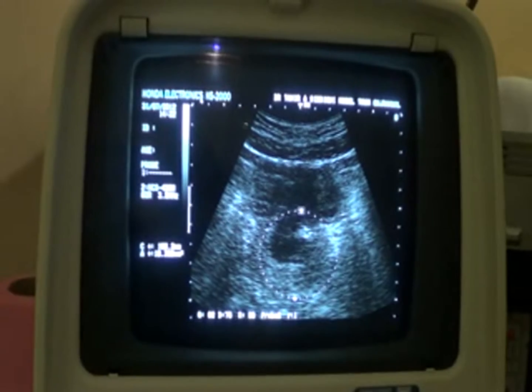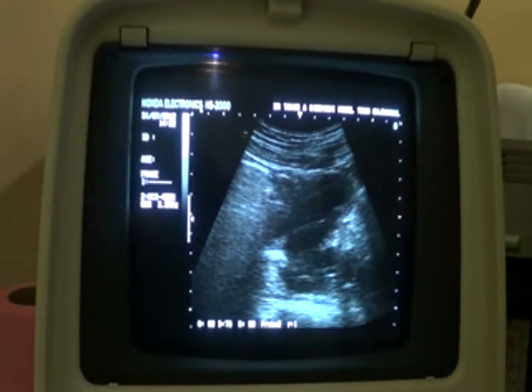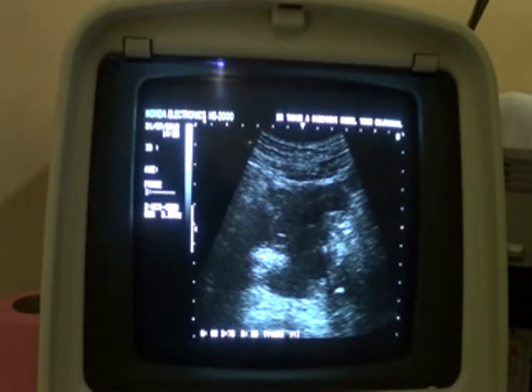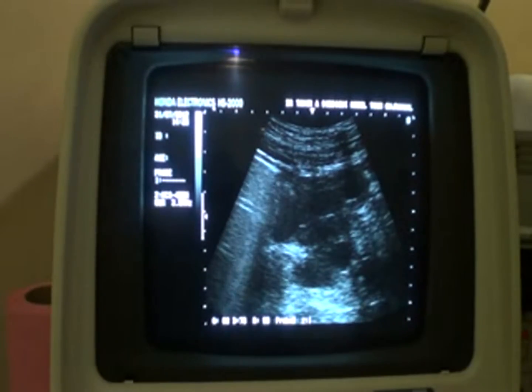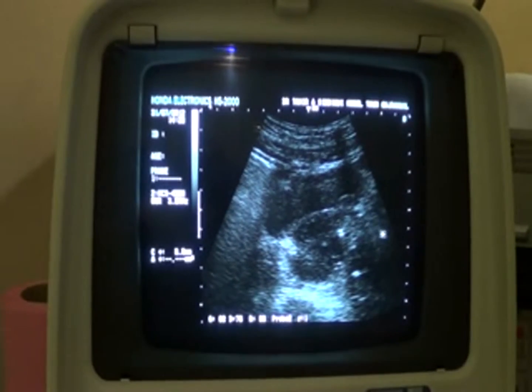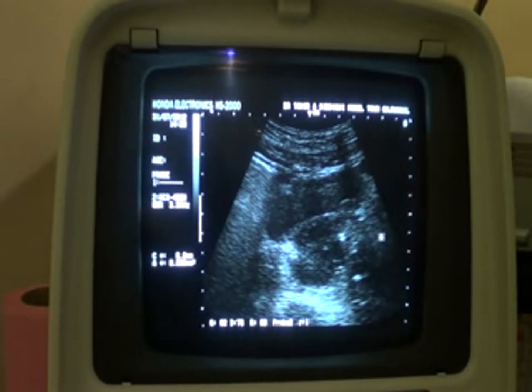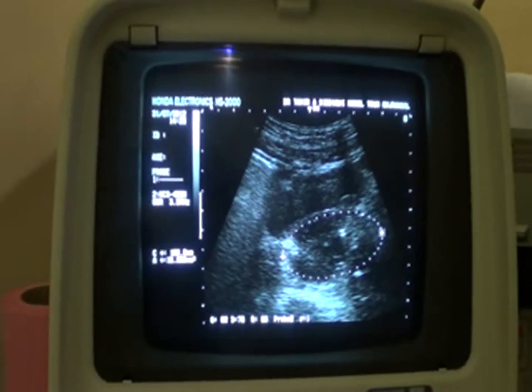Now this is the area of the prostate in transverse section, and this is the prostate in longitudinal section with both cystic areas now being seen clearly along with the prostatic urethra. Let's do it again. Okay. Now this is the prostate with a normal dimension. I have magnified the view in fact. Now this is the prostate by itself.